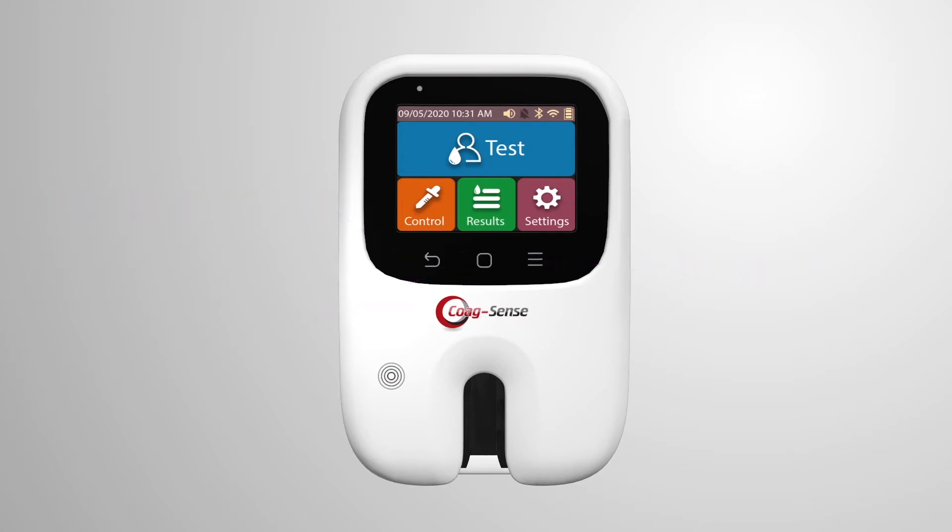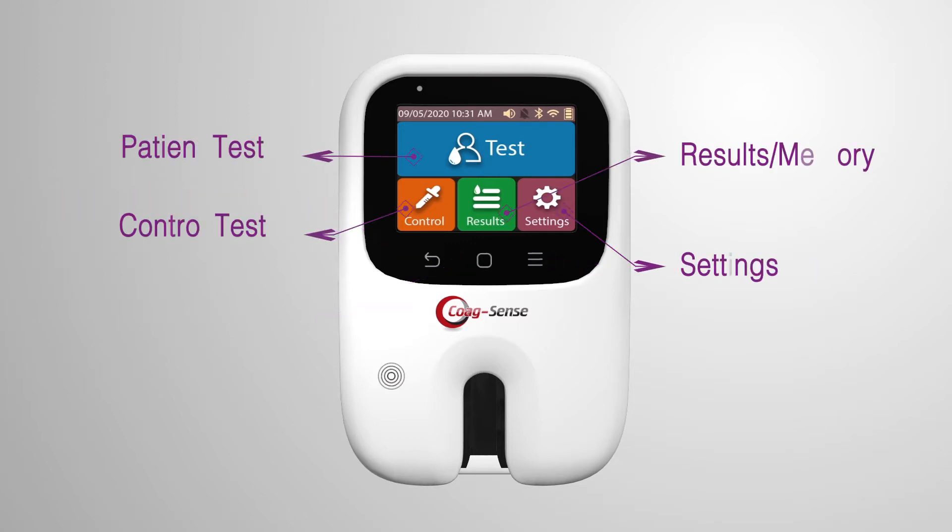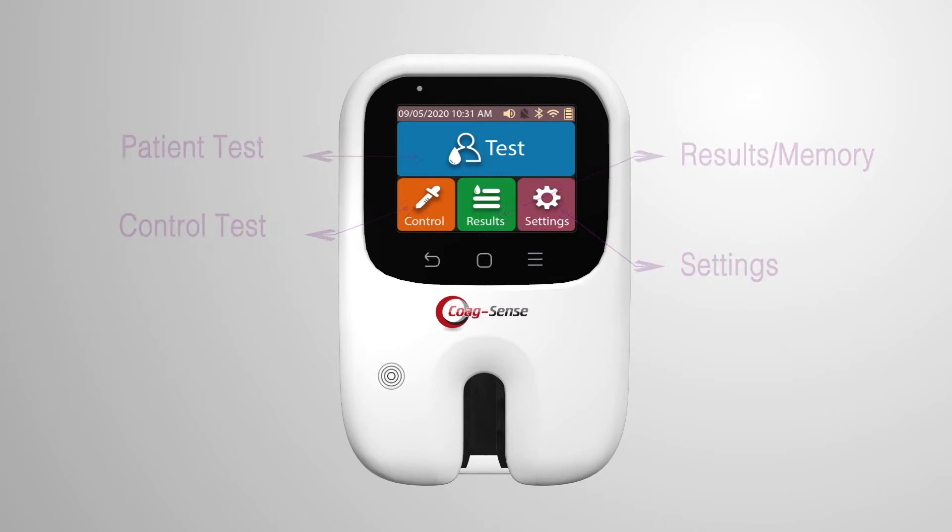The color LCD touchscreen shows icons for patient test, control test, results or memory, and settings. The meter performs a self-check when it is first powered on and every time a test strip is inserted.